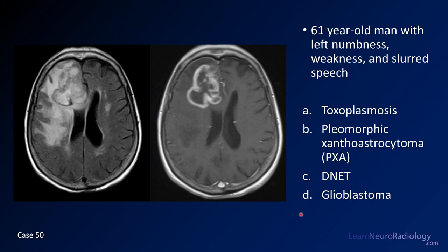Case number 50 is a 61-year-old man with left-sided numbness, weakness, and slurred speech. We have a FLAIR and a post-contrast image. Your choices are toxoplasmosis, pleomorphic xanthoastrocytoma (PXA), DNET, or glioblastoma.